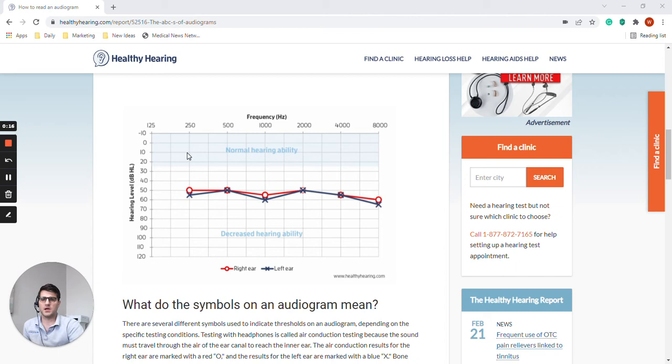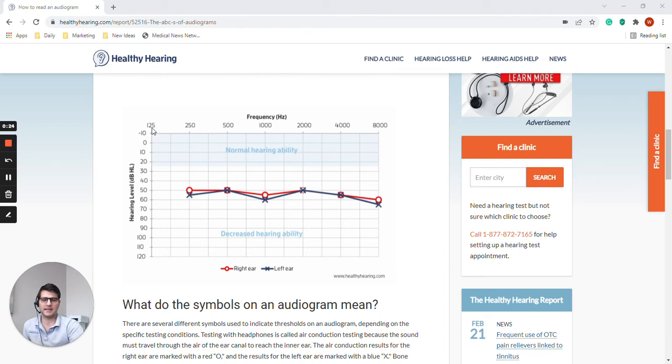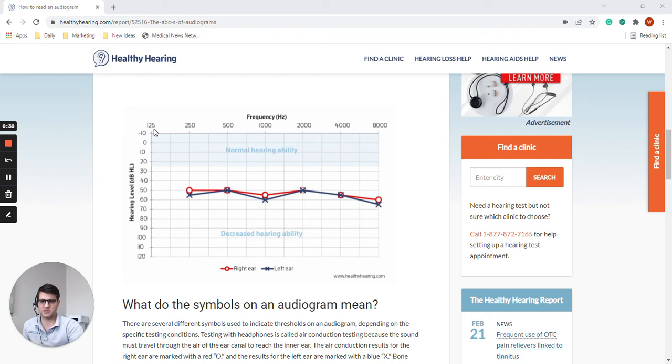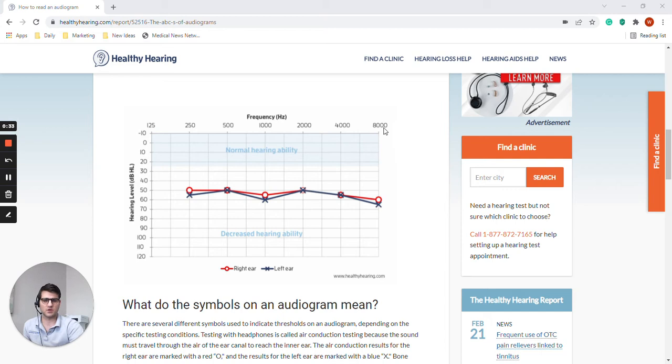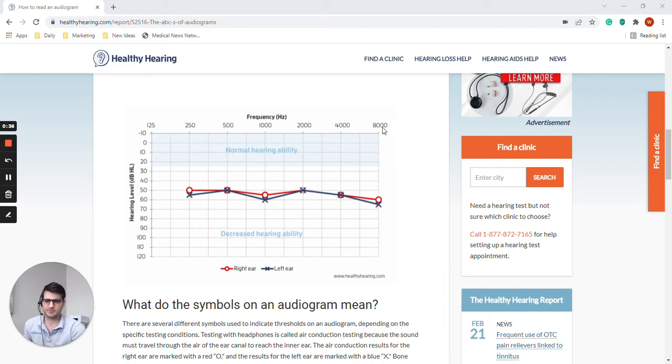Along this graph on the horizontal axis we have frequency, and frequency increases as we go from left to right. So 125 hertz is low frequencies, low pitches, and the pitch increases as we go across to the right of the graph.